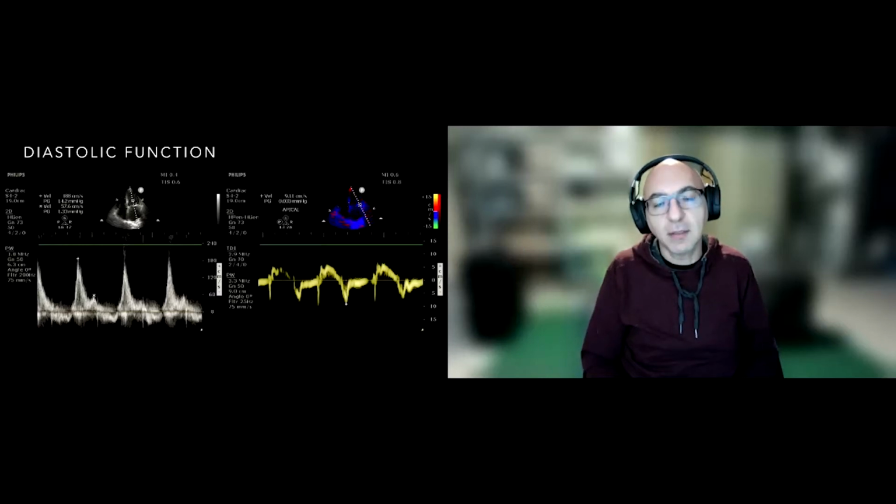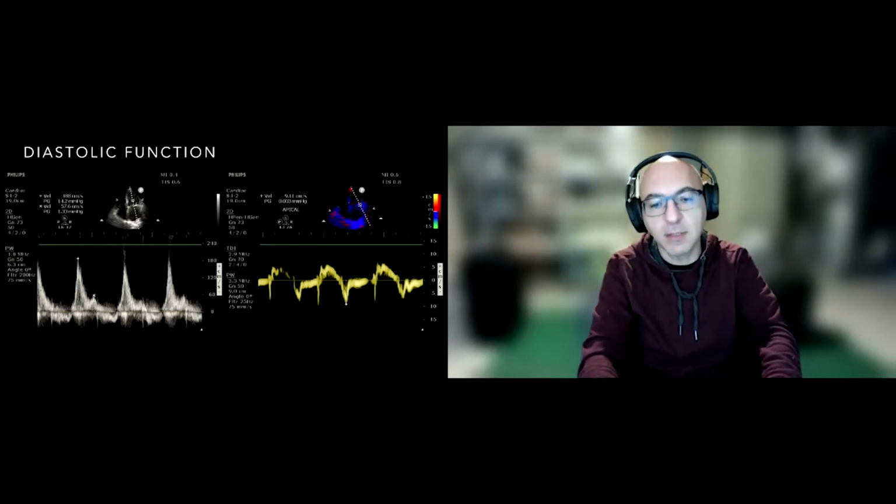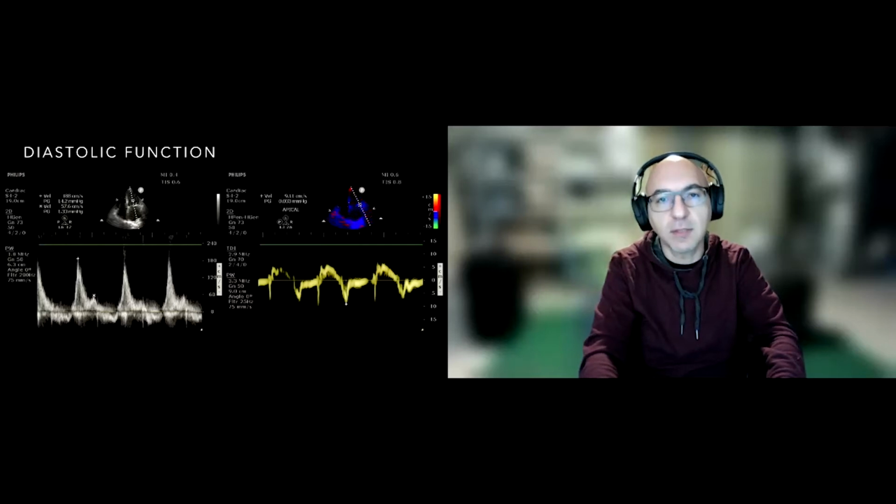Yeah, exactly. And there are lots of nuances, of course, in cardiac function. Is there valvular disease? Are there other reasons for the hypotension, like sepsis, and not just cardiac dysfunction? But that's what happened during the pandemic, and might happen again with influenza: you get a patient with pulmonary edema, and you need to know if this is high pressure or low pressure pulmonary edema.